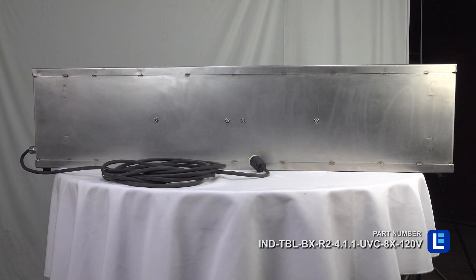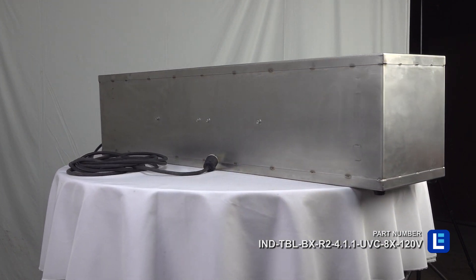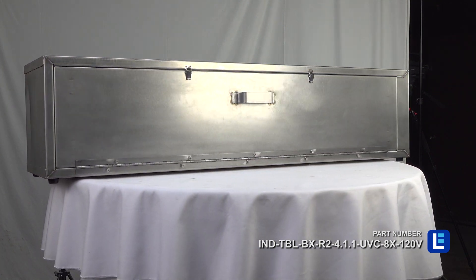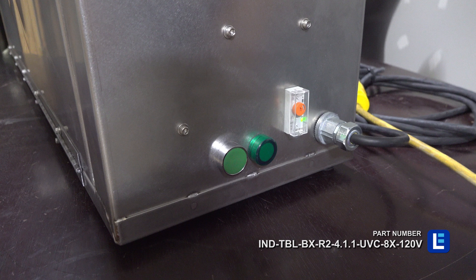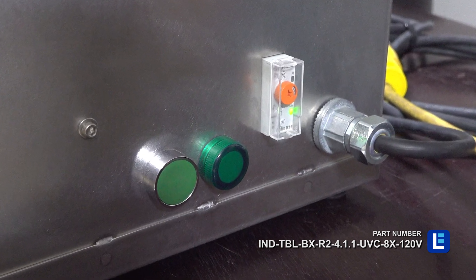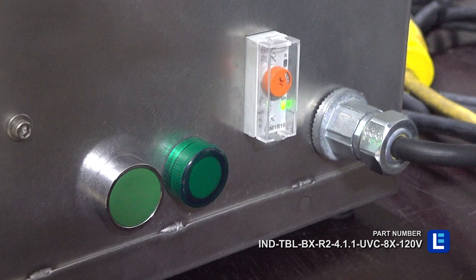With access to eight 40-watt UV lamps, this unit offers UVC output at a range of 200 nanometers to 280 nanometers. The 304 stainless steel disinfection box comes with a timer, external indicator light, and an automatic shut-off safety feature.